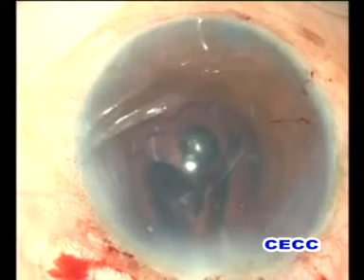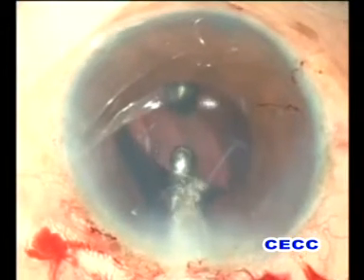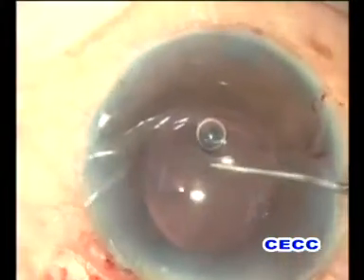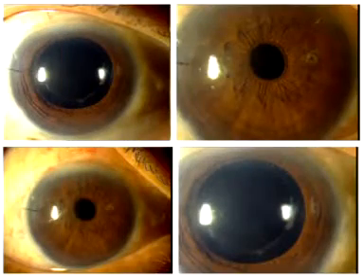A Rayner-designed hydrophilic intraocular lens was implanted within the capsular bag. The pupil was constricted with intracameral miochol and was small and round at the end of the surgery, thereby indicating the absence of vitreous in the anterior chamber. Post-operatively, the patient was followed up for 6 months and has a best corrected visual acuity of 20/20 till the last follow-up.